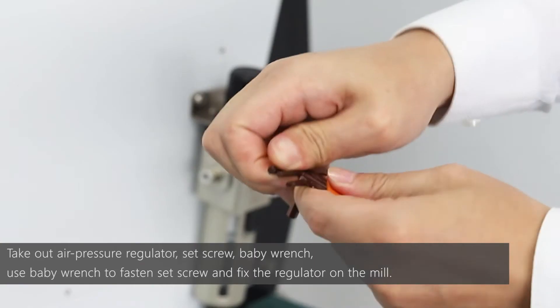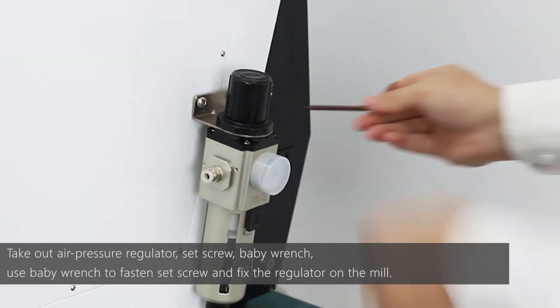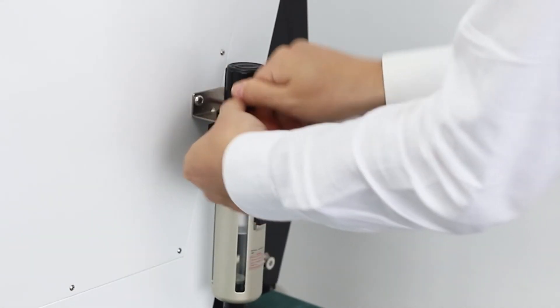Take out the air pressure regulator and set screw. Use the baby wrench to fasten the screw, and fix the regulator on the mill.